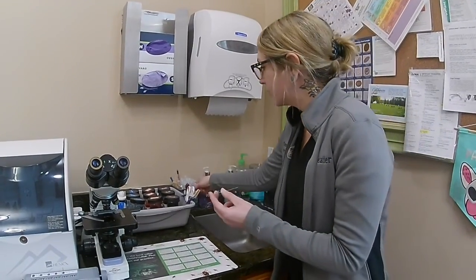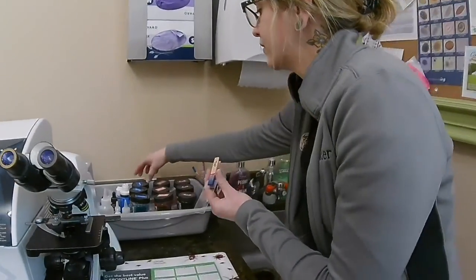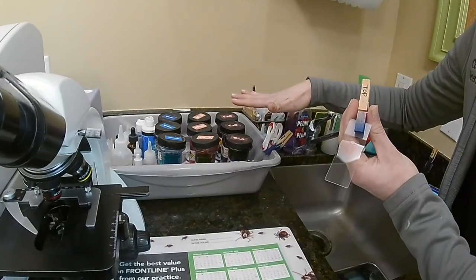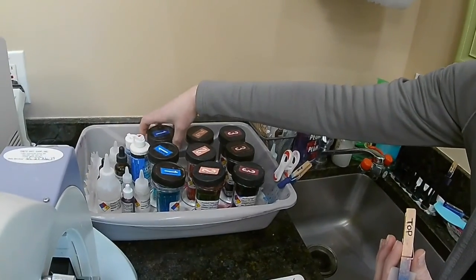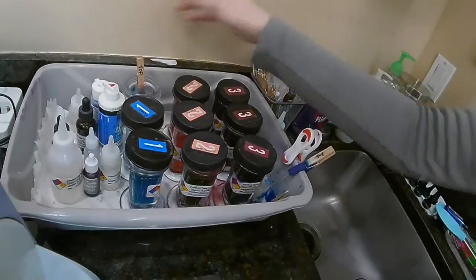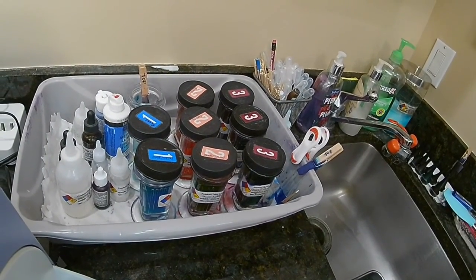So I'm going to put a little clip onto my slide here. We have different ones for each type of cytology we're doing, so we're going to use the one for blood today. So I'm going to start with the fix back here. Ideally, you want this to sit in there for about 60 seconds. So I'll start timing that.